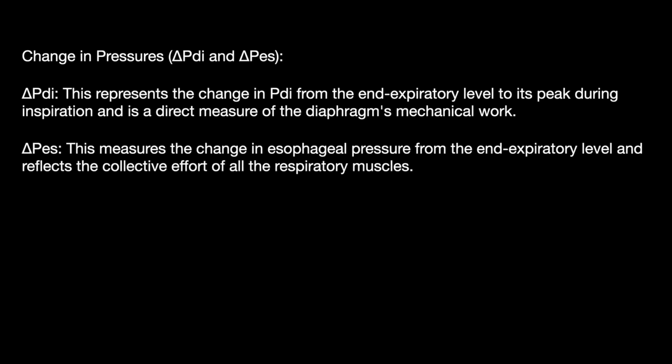The delta esophageal pressure is the change in the esophageal pressure from the end expiratory level and reflects the collective effort of all the respiratory muscles. So the delta PDI represents the work of the diaphragm from end expiration to the peak, and delta PES, that is esophageal, reflects the effort of all the respiratory muscles.